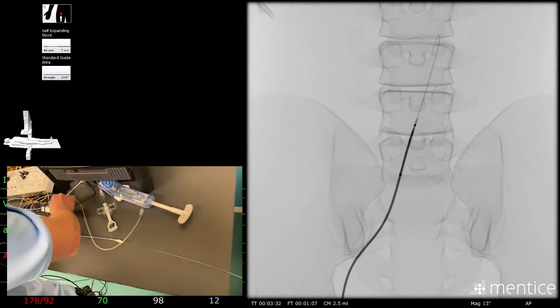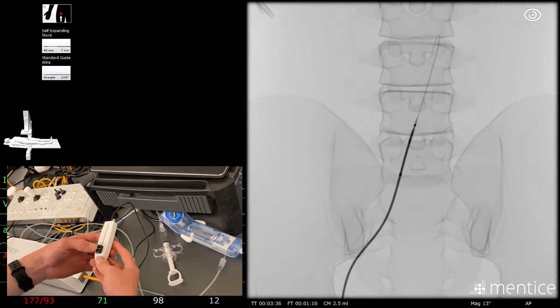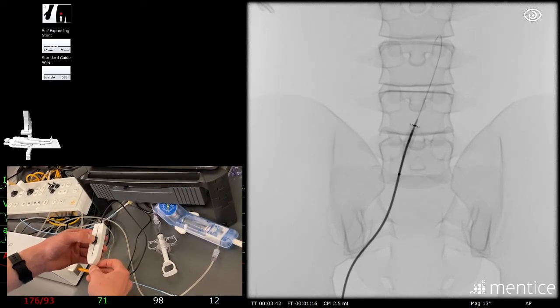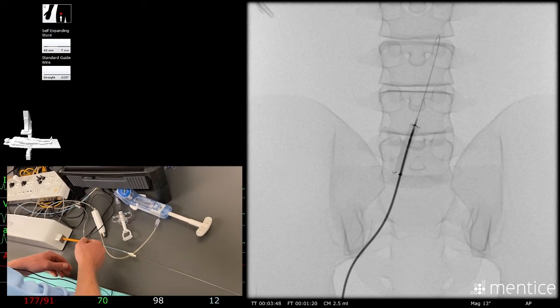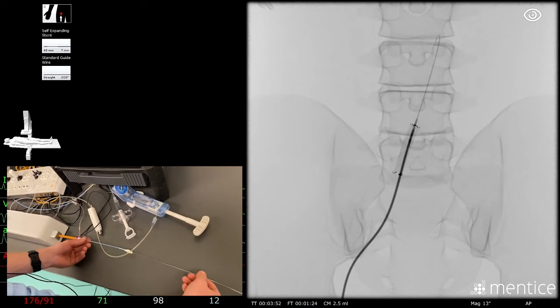And for this we use this little device here, and simply all we do is bring it from bottom to top up towards the cable, and it should just release like so. Simple as that. We can't inject through this stent, so we'll remove it now.